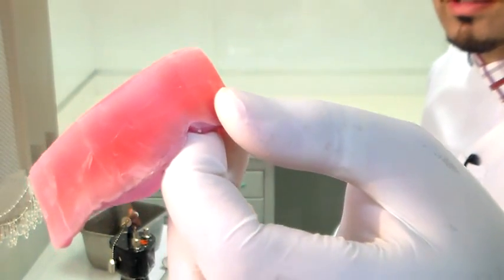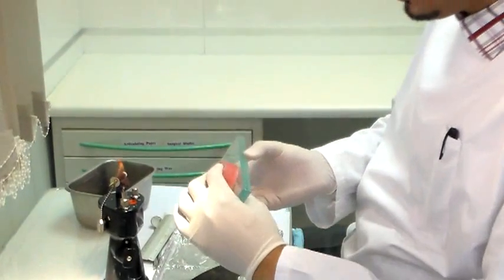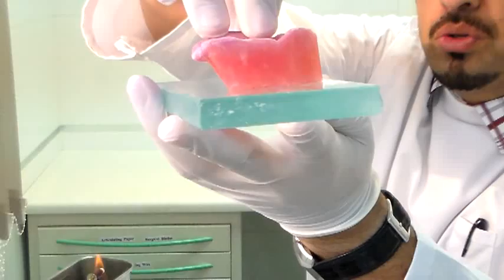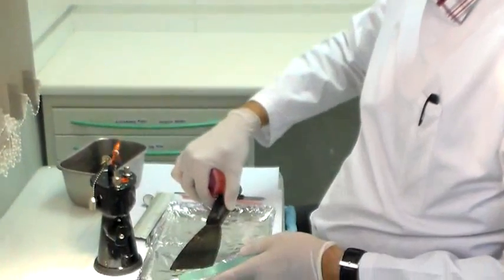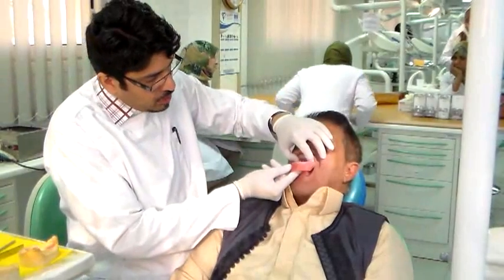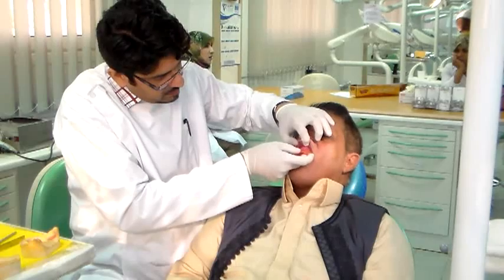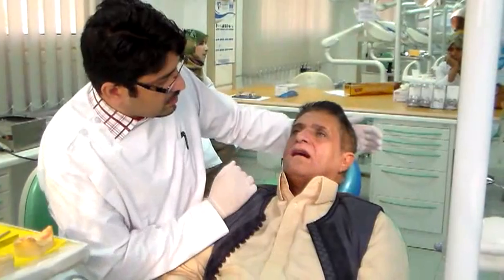Can you see the line and the reduction till there? Once you've done the reduction, you always want to check it on a glass plate to see if your plane was reduced in one plane or whether there are different planes developed. You want to always reduce it in one plane so there's constant contact on the glass plate. Then go back into the patient's mouth and check — the visibility is still pretty good.